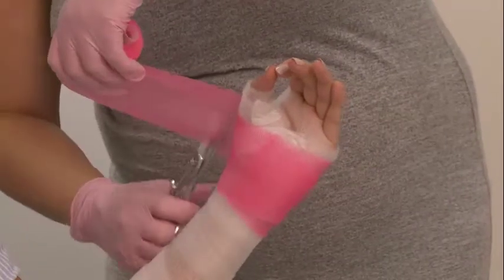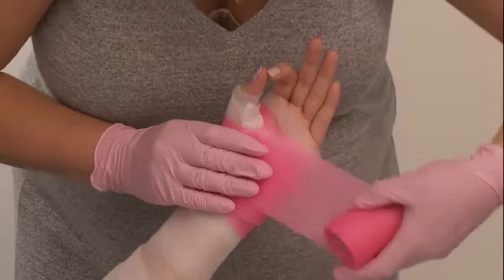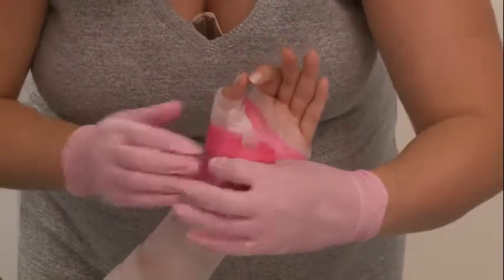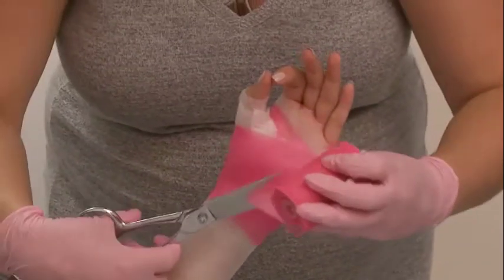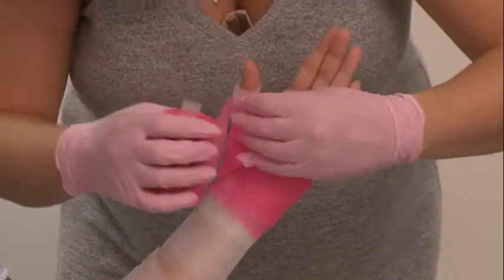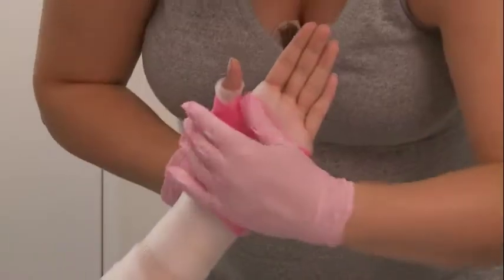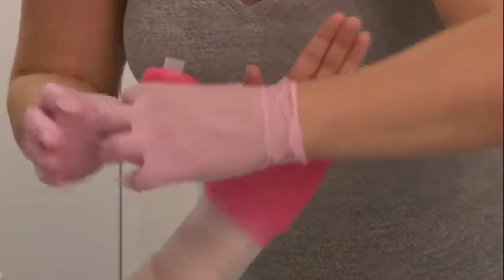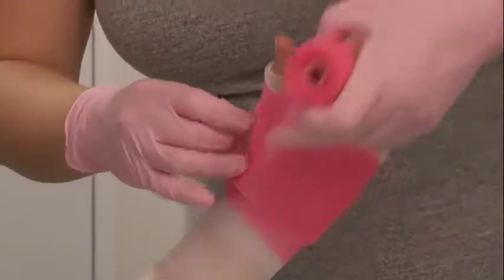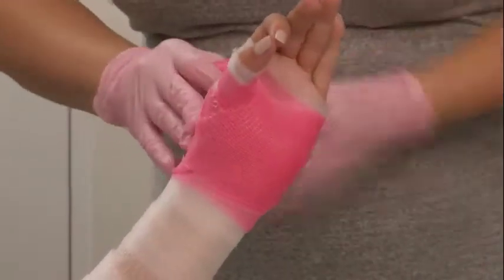Be quite careful with your positioning of the cast material at this point. We're going to do about four layers — two through the web space and two through the thumb. With the roll we're doing one through the web space, then we come back and do the thumb. The cut you're making in the material — you want to leave enough material, about two centimeters, to cover the IP, so it's about the length of the IP you're going to come around. It doesn't matter too much about the edges here because you'll capture those sharp edges when you do your web space layer. Coming back through the web space, this incision you only want to leave about a centimeter — about half of what you left for the other layer — so you're not adding too much bulk through the web space.